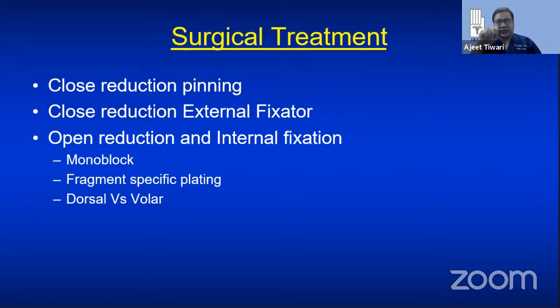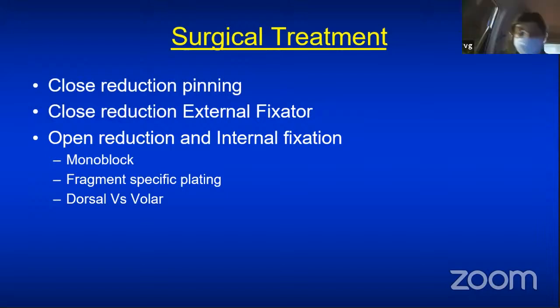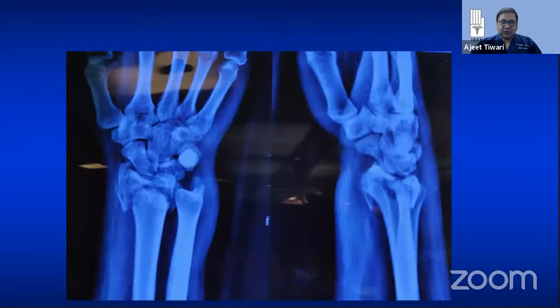So this is a severe combination, and there are multi-fragmentary fractures. So I think this is not a candidate for closed reduction. This patient requires open reduction and internal fixation.